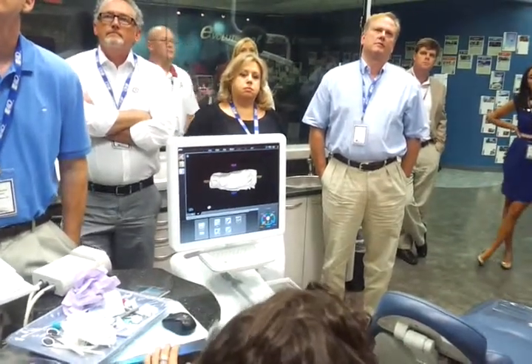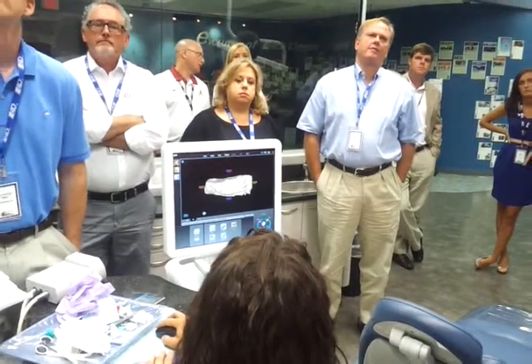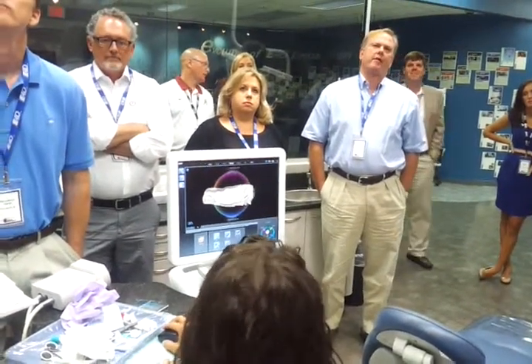Now this is a multiples case. Alright, I wish I would have had Terry here today. She just has one tooth prepped. It would have been much faster and easier for me, but we're going to do both.